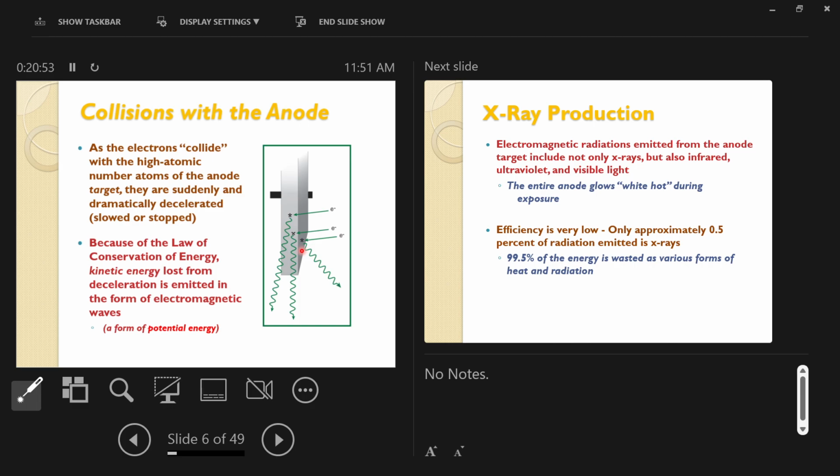So one more time, what are the three things we need to make X-rays? What's one of them? Energy power. So we need something. So let's start with Lewis. We need a source of electrons, right? What's the source of electrons? Good, filament wire. Now we've got a cloud of electrons around the filament wire, that's our source. What are we going to do with them? Accelerate them. What do we accelerate them with? Voltage, which does the push and pull. We call that an electromotive force, EMF, okay?